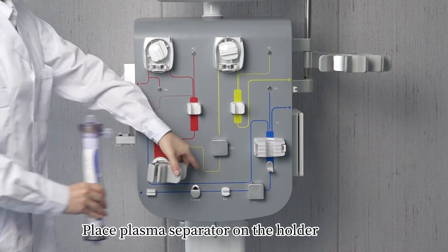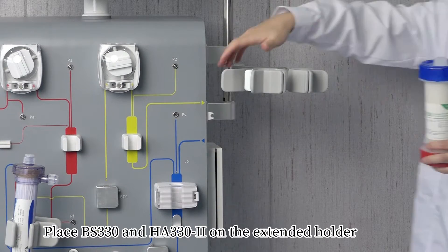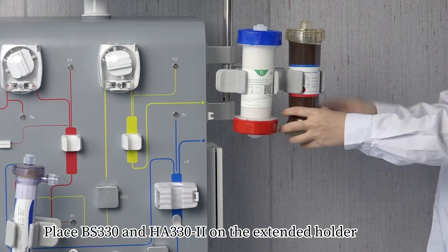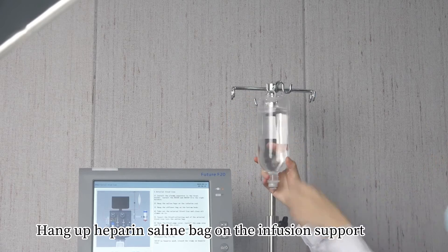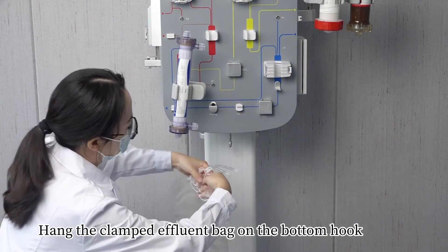Place the plasma separator on the holder. Place BS-330 and HA-330-2 on the extended holder. Hang up the heparin saline bag on the infusion support. Hang the clamped effluent bag on the bottom hook.